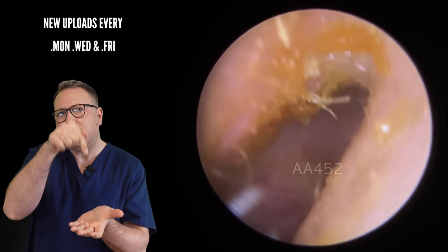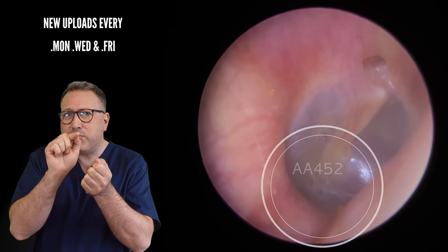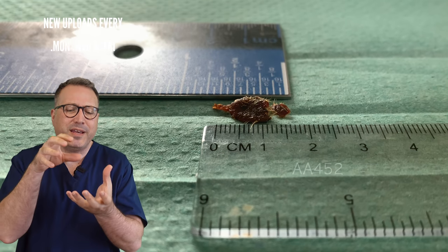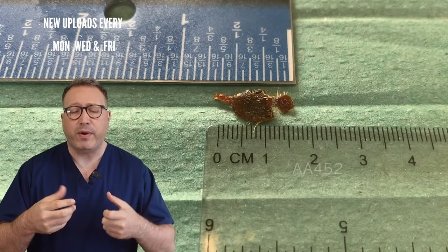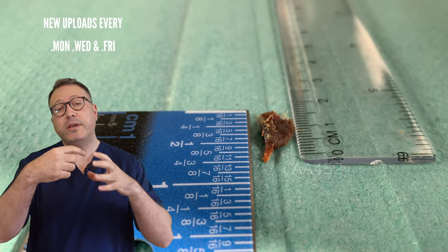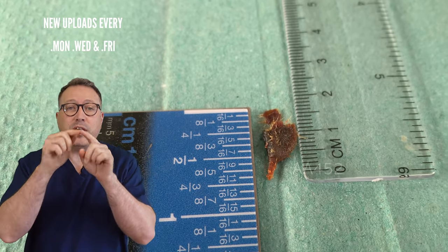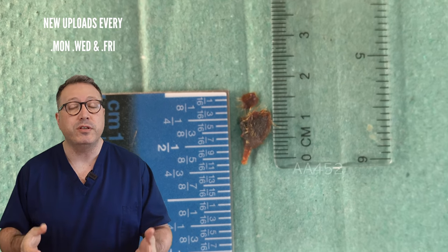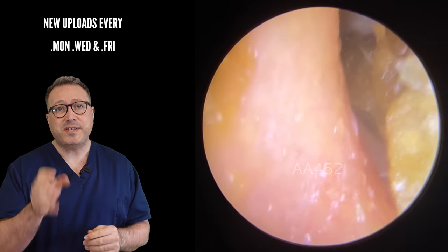This patient had also been experiencing some popping and crackling. When we take a look at the eardrum, have a look at the bottom — you'll see lots of outlines there. Those are outlines of air bubbles. What's been happening is this patient has been getting some fluid in the middle ear space, and every time they yawn, swallow, or chew, the eustachian tube opens allowing air in, which bubbles up through that fluid. Those outlines are where the bubbles have stuck to the back of the eardrum. It's quite common to see these after someone's had a bout of middle ear effusion and it's starting to drain away.